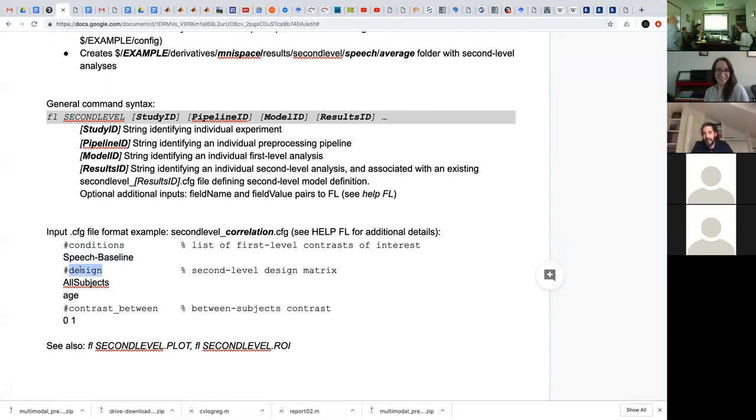I think we have it in some of our videos, right? And we should have that particular talk. So that's kind of the logic of how a second level analysis is specified. And just a very brief overview of what we talk about there is that in order to specify a second level analysis, you have to specify four things.